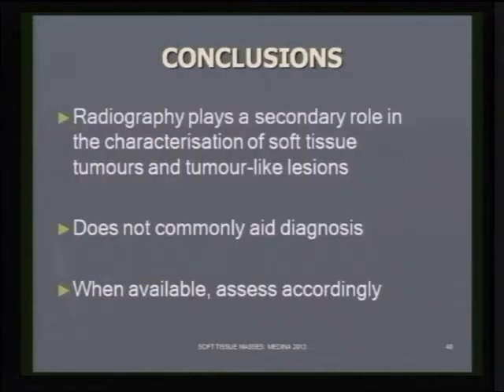So in conclusion, radiography plays, I think, a secondary role in the characterization of soft tissue tumors and tumor-like lesions. We do not routinely perform plain radiographs. The majority of our patients would be referred with an MR study. If we have a radiograph available, then we will assess it according to the principles that I've discussed already. But usually, in my experience, it does not aid in the diagnosis of soft tissue tumors.